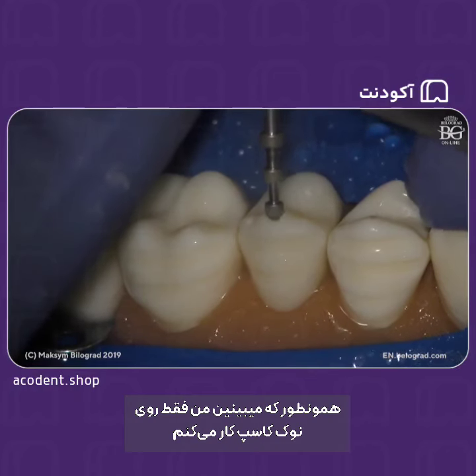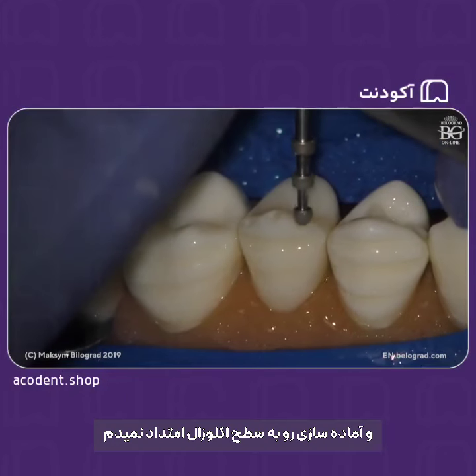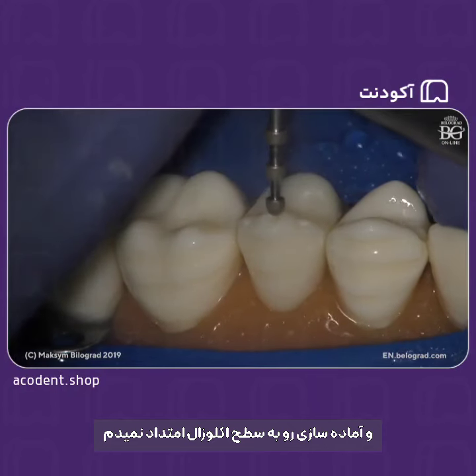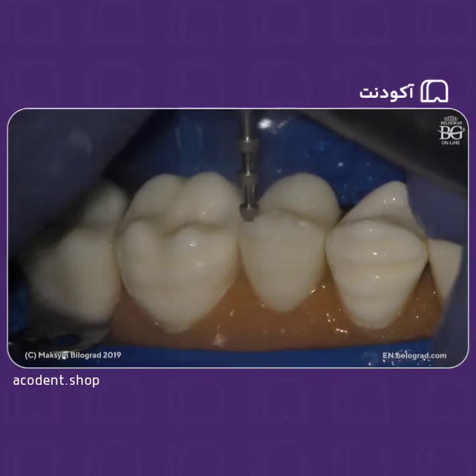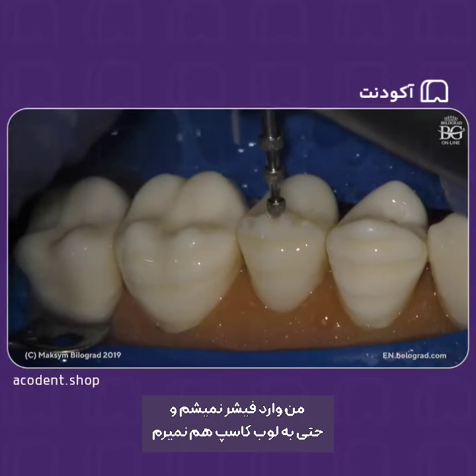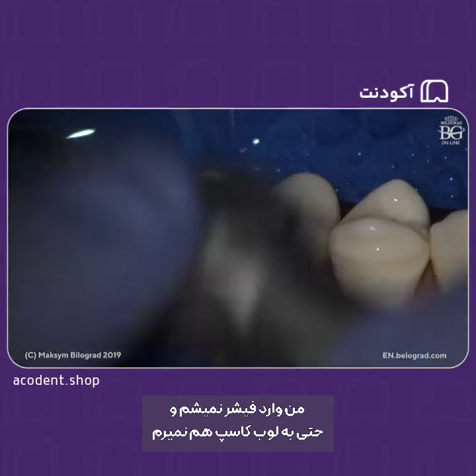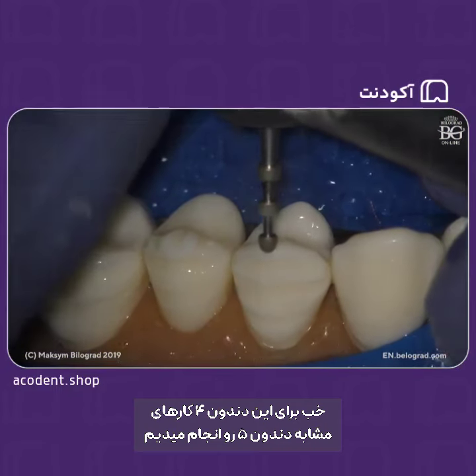Okay, see, I'm just working on the tip of the cusp, and that's it. I'm not prolongating my preparations towards the occlusal surface. I'm not going to the fissure. I'm not going to the cusp lobe here. Okay. As for this premolar, we will do everything.